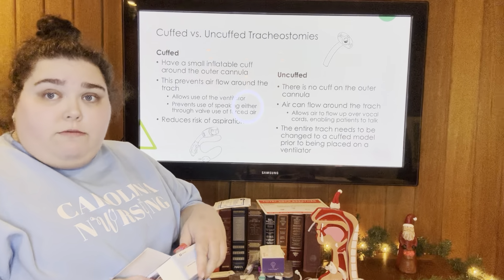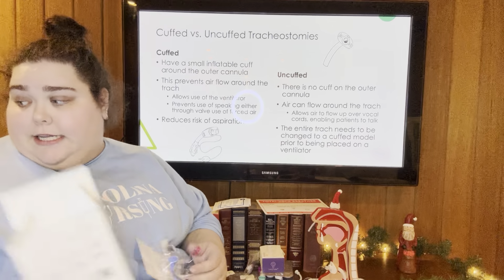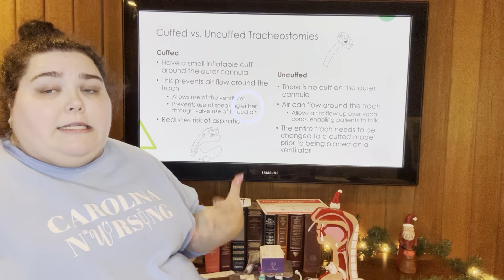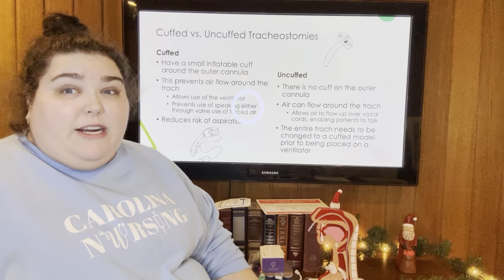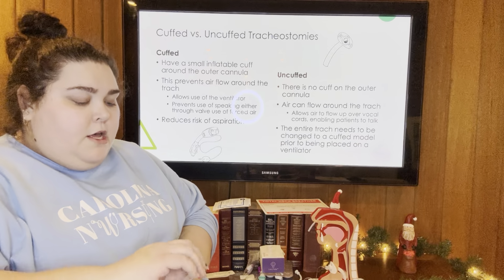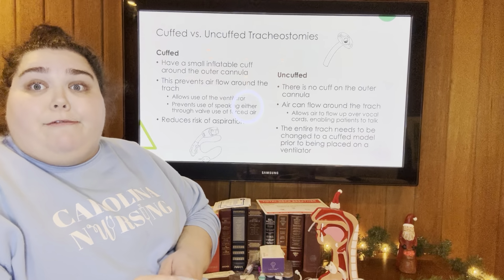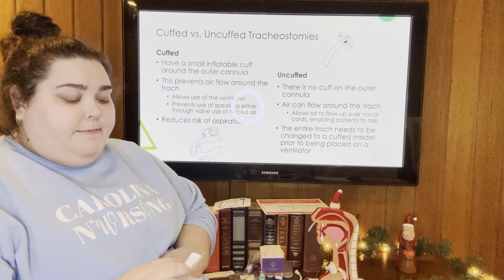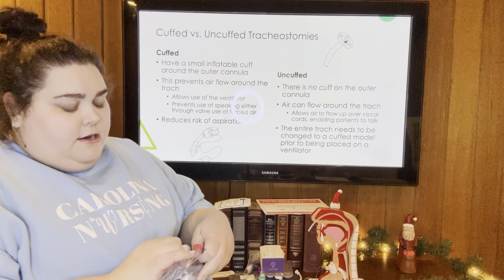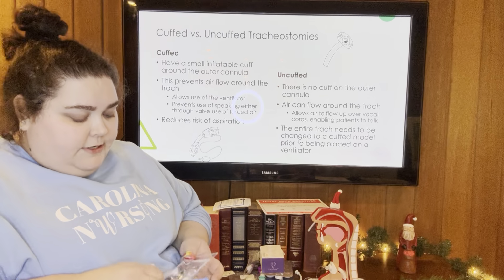In regular life, if Tom was going home, he's not necessarily going to want to have to fuss with his little dangly bit here. It's going to be kind of cumbersome for getting around and doing things. So we want to put him on an uncuffed trach. So the uncuffed trach is the same thing, it just doesn't have a cuff. It's a pretty straightforward situation there. So we'll open this up. This is a size 7 uncuffed trach, so it's a little bit bigger, so you can kind of see the difference there as well.